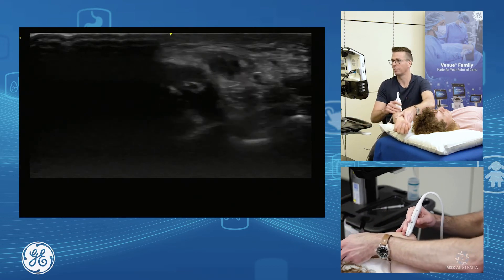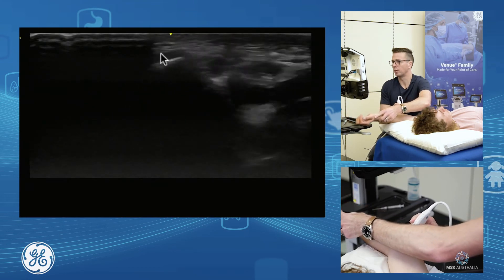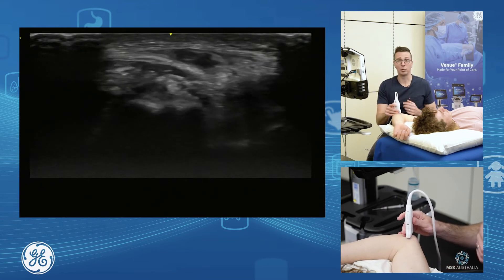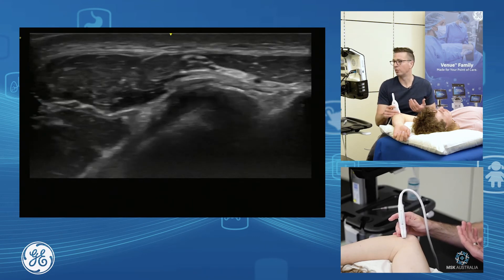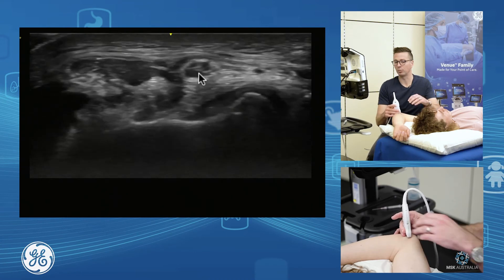Usually these get the most irritated when you have a bit of bony spurring on the common flexor, or if you do this a lot, it sits out of its position. But where most of your compression tends to occur is down between the two heads of flexor carpi ulnaris — the FCU aponeurosis, or Osborne's fascia — and this is where it tends to be compressed a lot of the time.